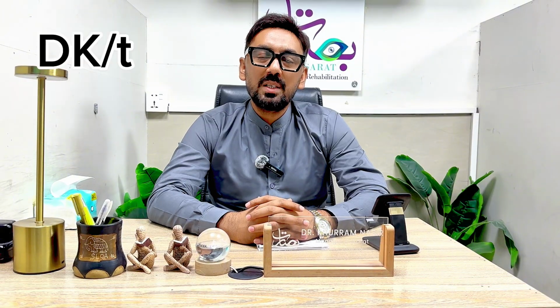Previously, people used the hard lenses. The material used in the hard lenses was polymethyl methacrylate, PMMA, and that material was very hard, hard to handle, and not even flexible. The very bad thing about the hard lenses was that the Dk over t value was almost zero. So what is Dk over t value?